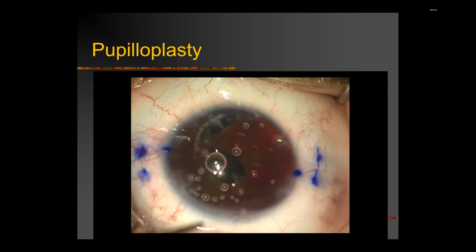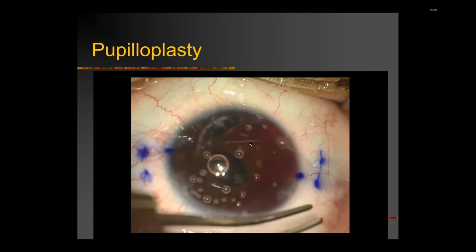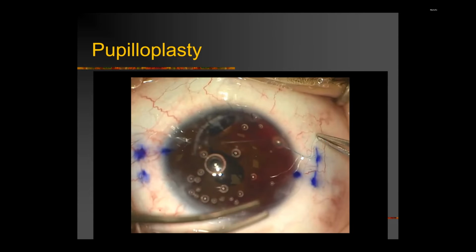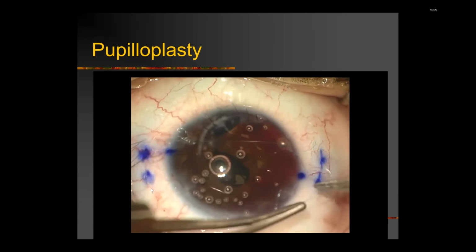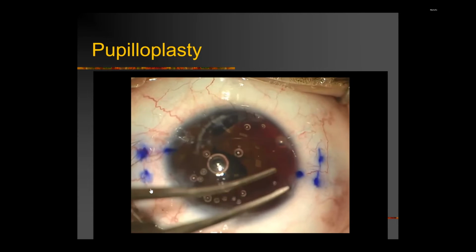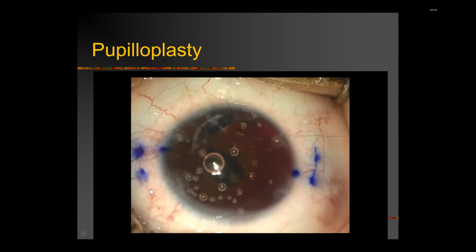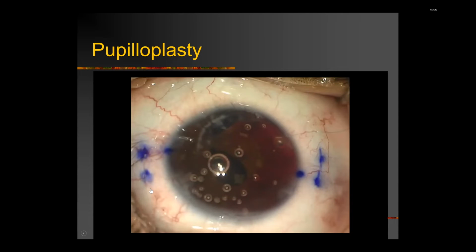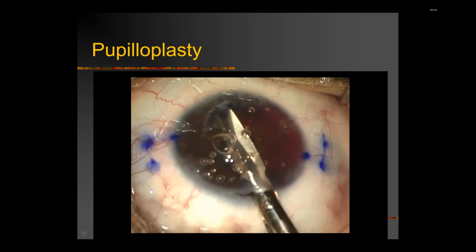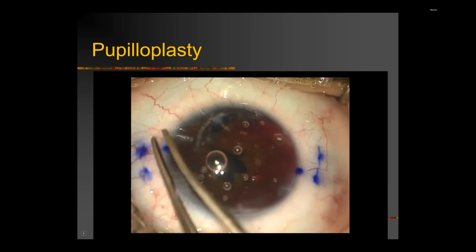Usually this is sufficient, but sometimes you may want to put a locking bite, and the same maneuver is done. A loop is made, hold the part of the loop that goes all the way through the cornea and make one throw to do your locking bite, and again gently the sutures are pulled apart to slide the knot back into place. The edges of the suture or the knot can be cut either by microcapsular micro scissors, or if a main incision to put the IOL is made, you can then use the regular micro scissors.